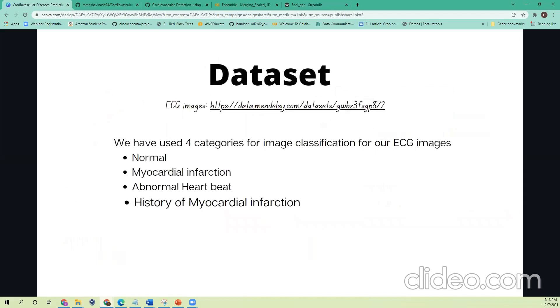We have done our research and found a repository where we found ECG images for our analysis. Based on the dataset, we used four categories of image classification for our ECG images: normal, myocardial infarction, abnormal heartbeat, and history of myocardial infarction. For the data preparation and pre-processing, I will hand it over to Avinash.